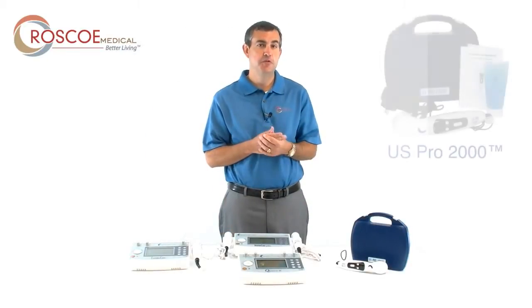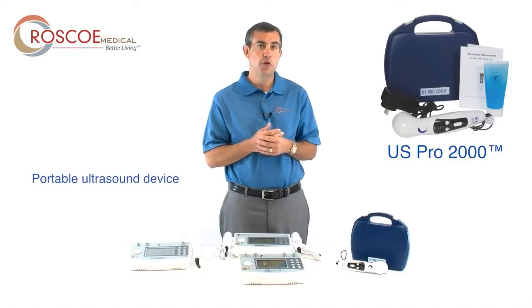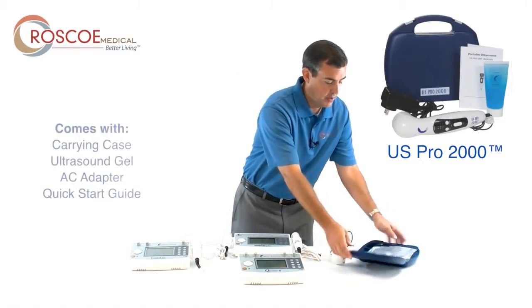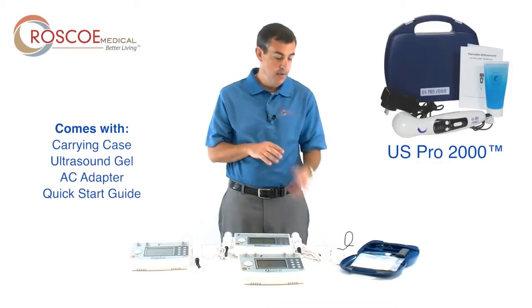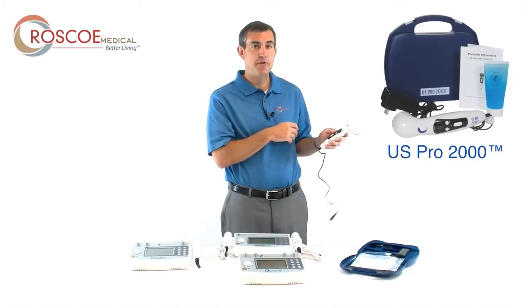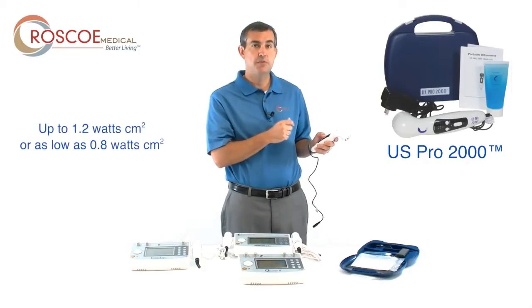I also want to tell you about the US Pro 2000. This device is a very nice, simple-to-use portable ultrasound device. It comes in a carrying case with ultrasound gel, an AC adapter, and a quick start guide. This device plugs right into the wall. You can turn the power on, set a timer, and choose high, medium, or low. You can go up to 1.2 watts per centimeter squared, or as low as 0.8 watts per centimeter squared.